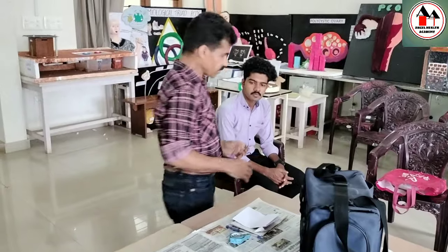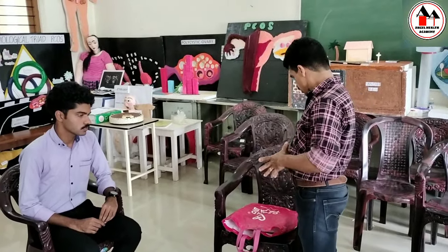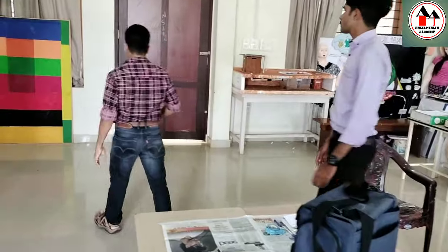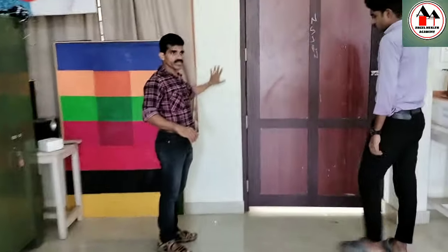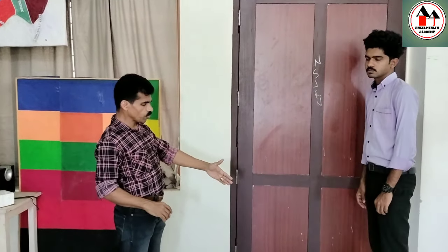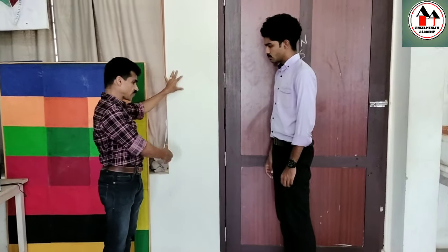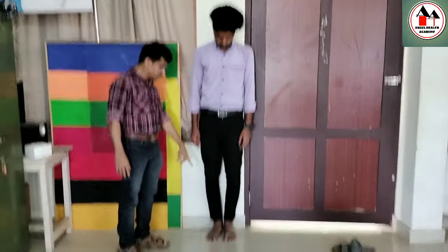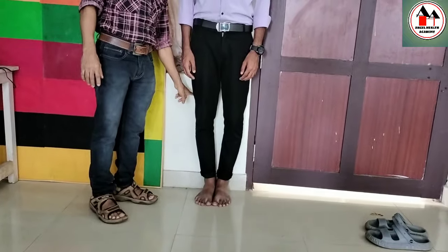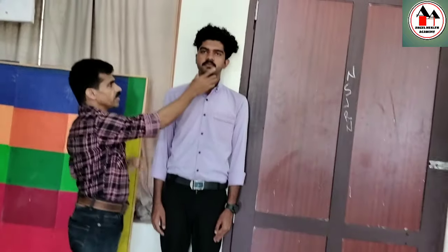So let us start the procedure. I have the patient here and I am going to check the weight and height. First, let us start with how to measure the height of the person. For that, you have to take the patient near to the wall — it should be straight up without any projections so that we can get an accurate reading. Ask the person to remove their slippers and stand towards the wall. Both feet should be together.